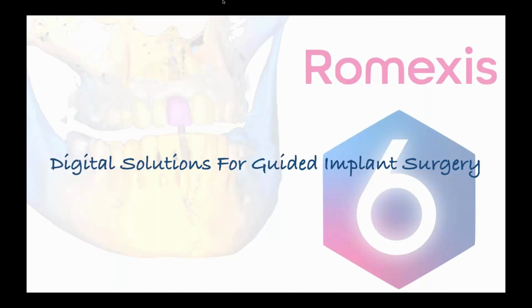Let's talk a little bit today about digital solutions for guided implant surgery. I'm going to create two themes. One is I'd love to walk through what we're using as a typical guided implant workflow and solution, a formula, if you will, that we've created that seems to be working really well for myself mainly in private practice, but also from the perspective of teaching our residents and our students.